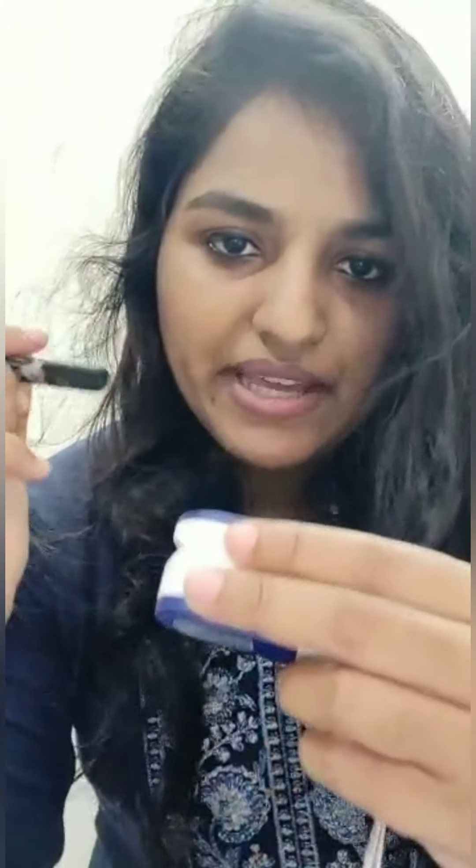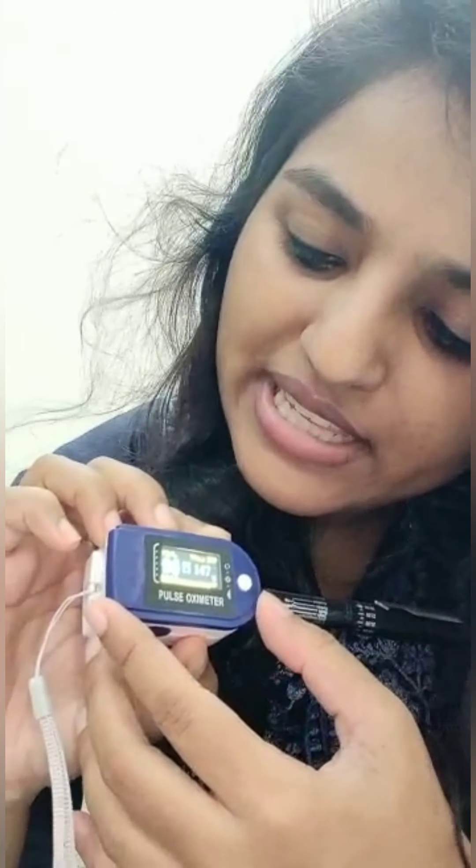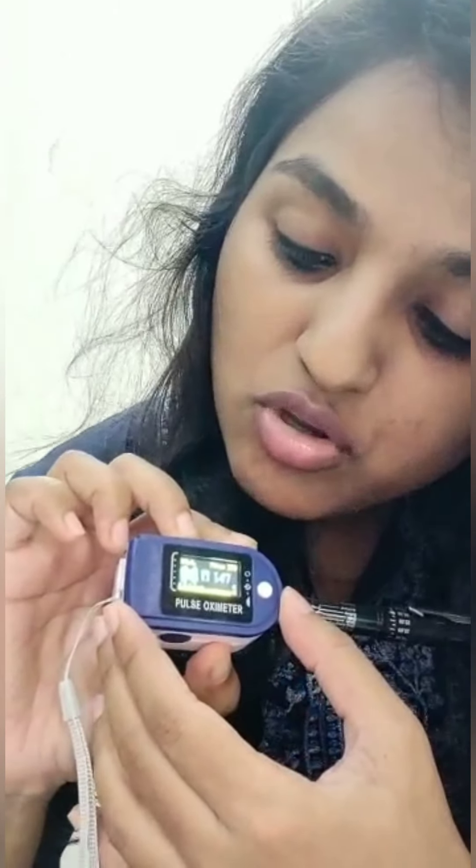Now I will try the same thing with my pen. I am putting my pen inside and then I am switching it on, just checking if it will show some reading. And you can see that even with the pen, after putting the pen in, it is showing that the pen has an oxygen saturation of 96 and a pulse of 147.